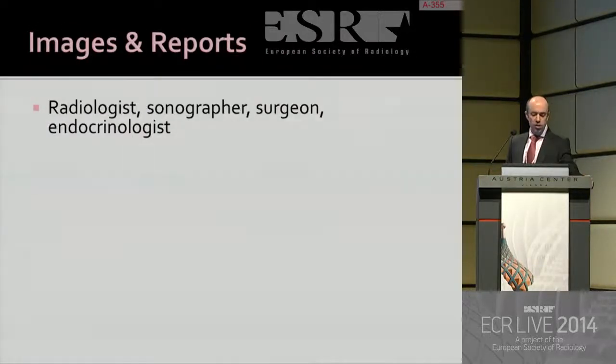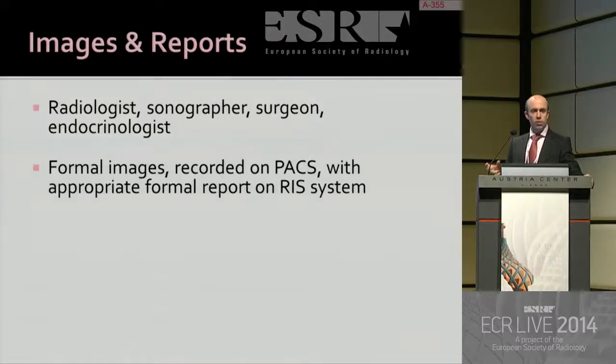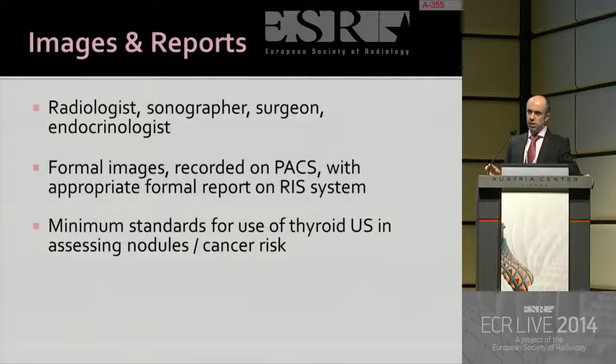Finally, as a role of a radiologist, we need to remember the importance of our report. So, as I mentioned, radiologists, sonographers, surgeons, endocrinologists, general internal medicine physicians, they're all starting to perform neck ultrasound in an office-based environment. We need to realise everyone performing thyroid ultrasound for the assessment of thyroid cancer and management of thyroid nodules, we should be recording images onto a PACS system. This should be allied to a formal documented report which can be looked at with the images. And these should be the minimum standards for anyone performing thyroid ultrasound.